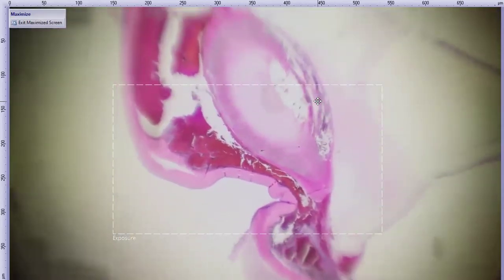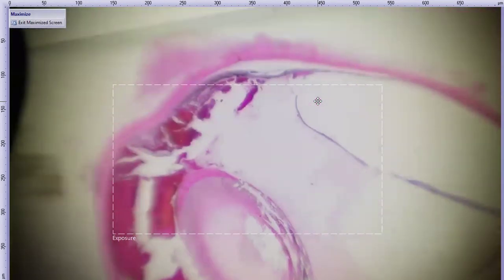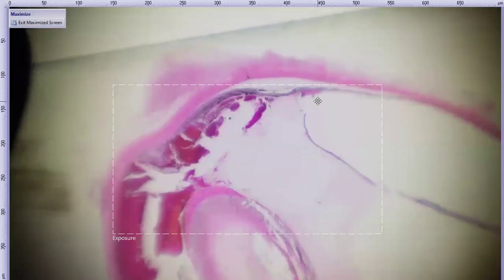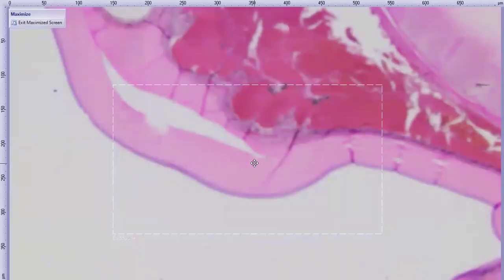Cornea. There's hemorrhage in the posterior chamber. Here's the lens. More hemorrhage in the posterior chamber. The retina is detached. And actually, the only area that foreign body is sampled is right there. So I didn't see this on my initial pass through this case, my very brief review.